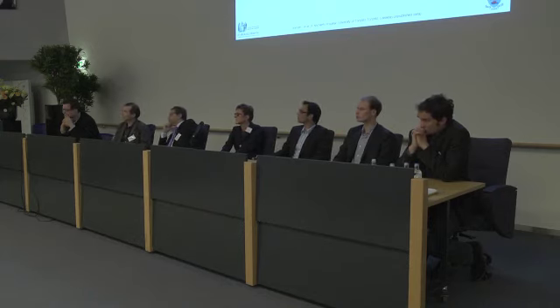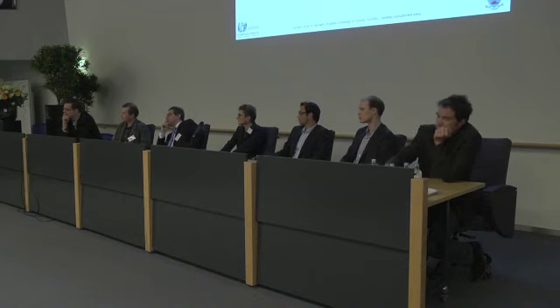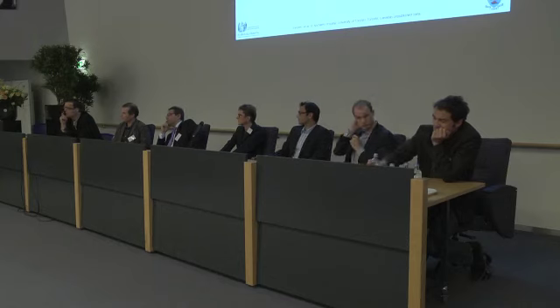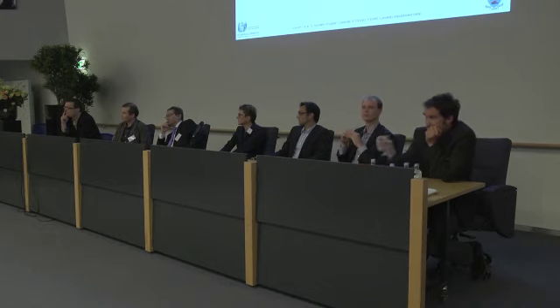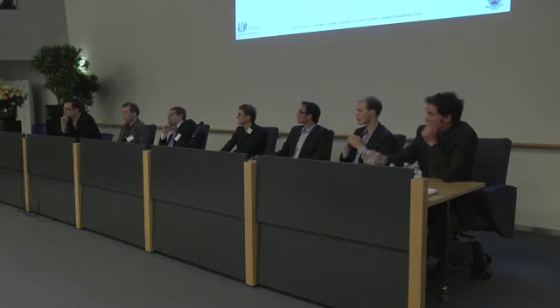Yes, thank you very much for a great session. And I have a question. Based on our experience with premature babies, we see two populations of patients. Those that we start on NAVA from the beginning are fairly easy to start, and ventilation is no problem. Then there is a second population of infants who are on a different mode of ventilation, and we start NAVA on them.